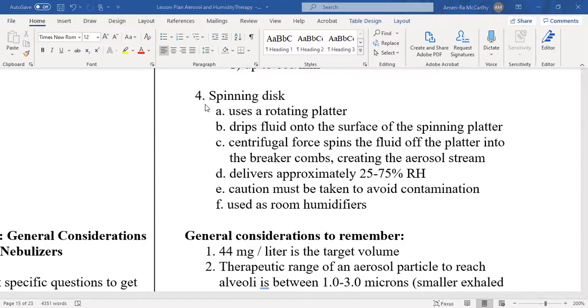And it sprays cool. You can see it come out. A little cool mist on my face. My mom used to wake me up and my little peach fuzz would be white because of that mist. I love it, and that helps me sleep. So to this day, I use a spinning disc nebulizer. I'm going to show it to you.